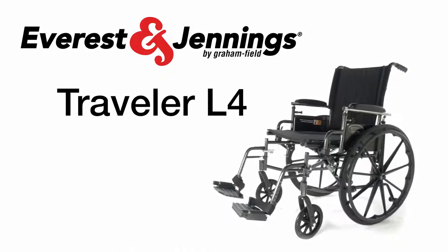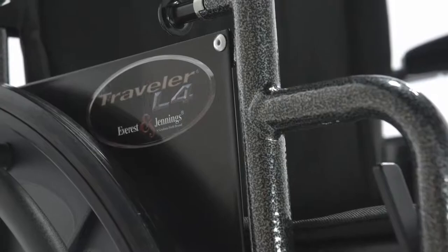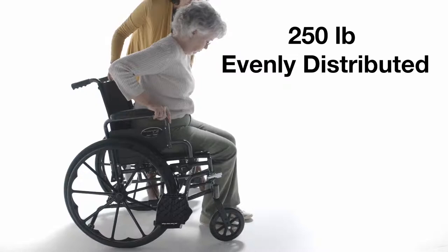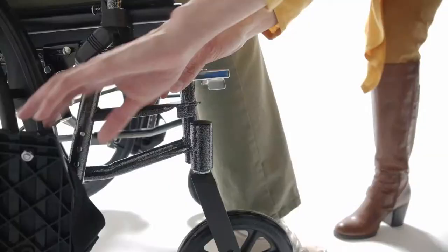The Traveler L4 is a high-strength, lightweight wheelchair designed for both the home and rehab markets. The carbon steel frame comes in hammer-toned silver vein and allows a maximum weight capacity of 250 pounds, evenly distributed, and 300 pounds on models with an 18-inch seat depth.